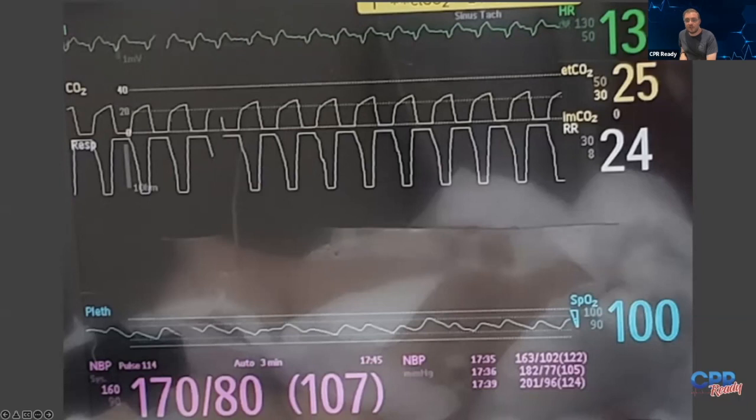So this is a patient that's telling you they're having trouble breathing. I can't breathe. I can't breathe. And you're looking at their O2 sat. It's 100%. And maybe you haven't said this before, but I've heard it said in the field at least, oh, you're fine. Your oxygen's 100%. There's nothing wrong. You're getting plenty of oxygen, as if it's all in the patient's head, right? But what does this capnogram look like to you? Does this look like something that we talked about just a few minutes ago? Looks like a shark fin, right? Look at that, nice little shark fin.